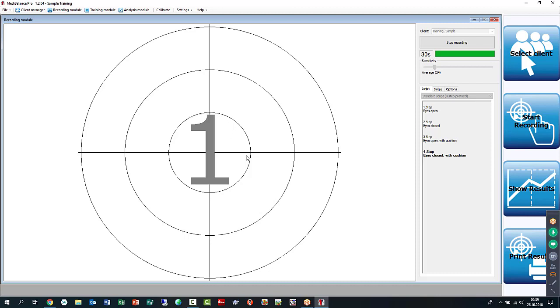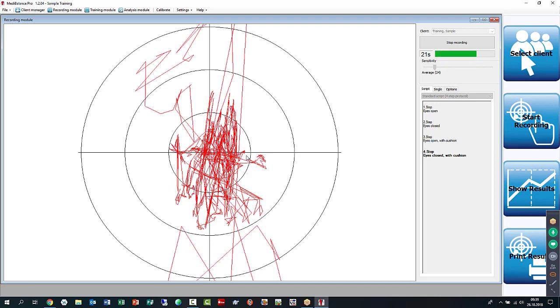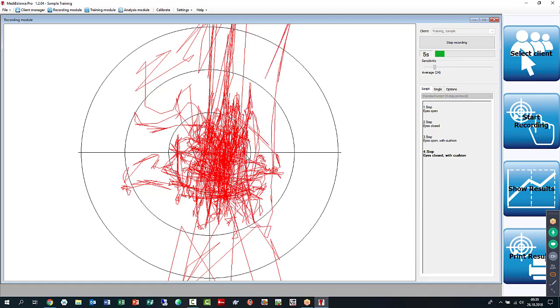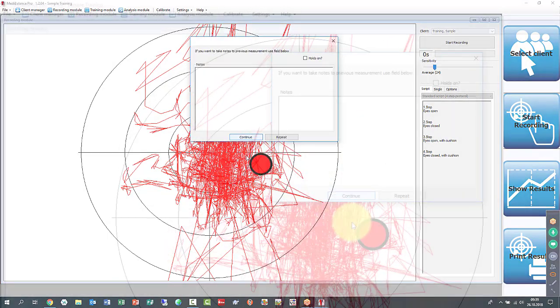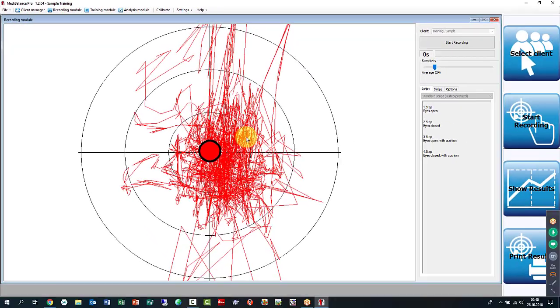Standing on the platform again. And now this client is so unstable. Okay, this is very pathological, but you will see people doing something like that. People are so unstable that they no longer have a very distinct movement pattern, front, left, but they actually have a lot of shocking movements like this one. So now that is done with, and this will be very pathological. I'm sure we'll see what the findings are. So I'll continue. It's done.